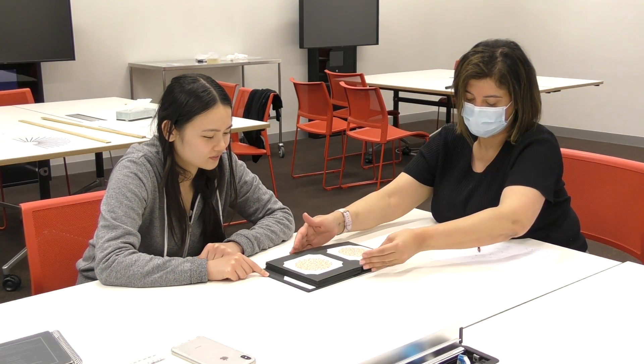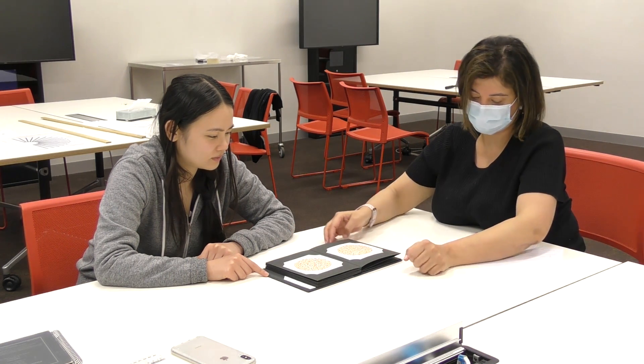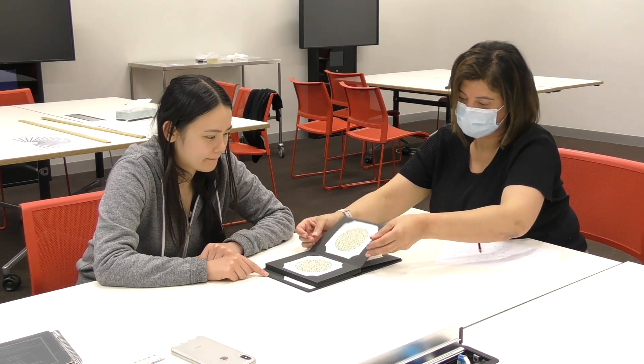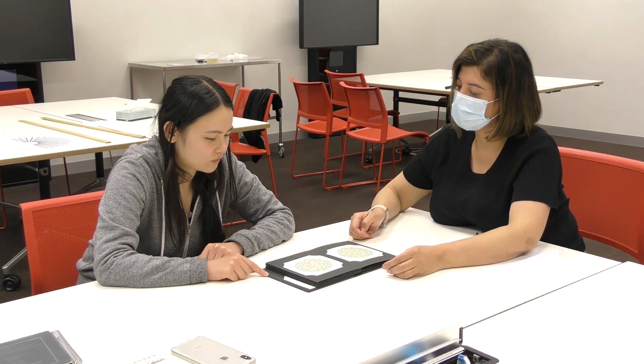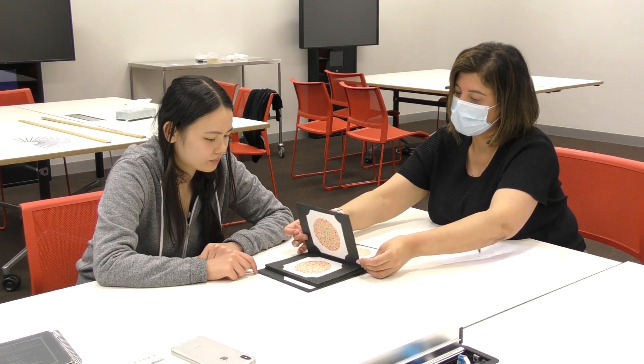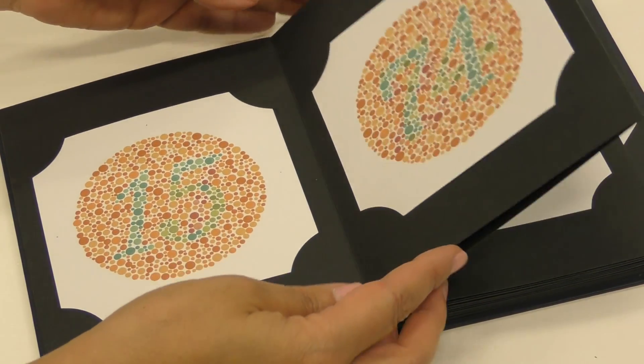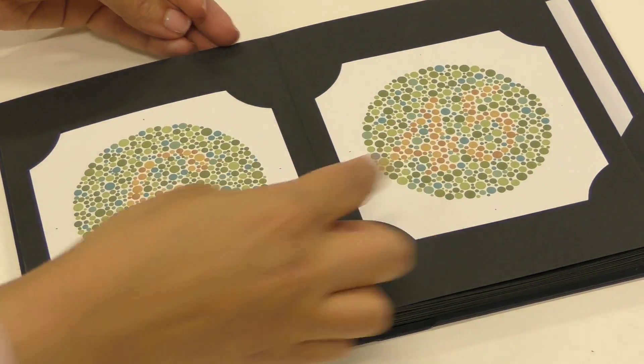The subject should be shown each plate, and they have three seconds in order to provide the correct answer. Plates 18 to 24 consist of a line which the subject will need to trace across the plate. The subject has 10 seconds to complete each trace. Now let's have a look at some of these plates to get an idea as to what these designs look like.